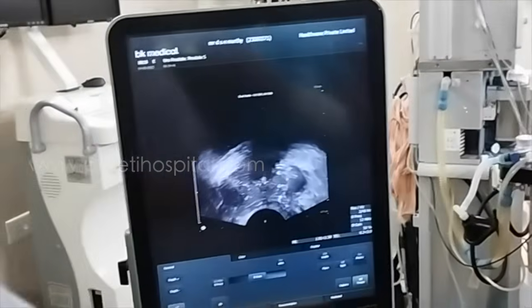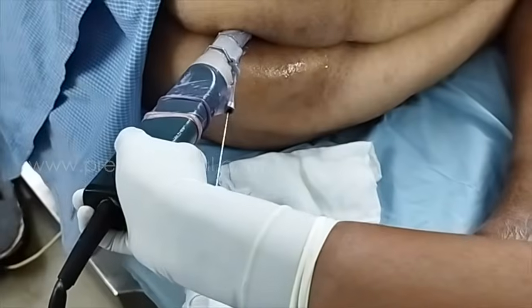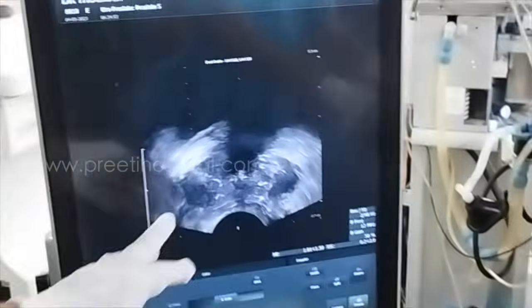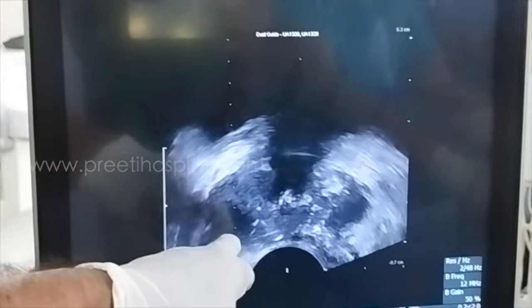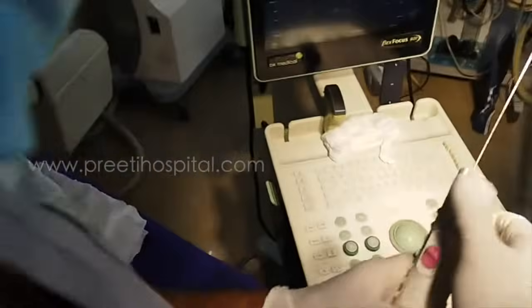End firing. So you want to start with end firing? End firing of the left side. Peripheral left side, go. There, be careful. In the middle you keep. Yes, in the middle, entire gland, transitional zone up to the anterior part, fibromuscular stroma also will come.